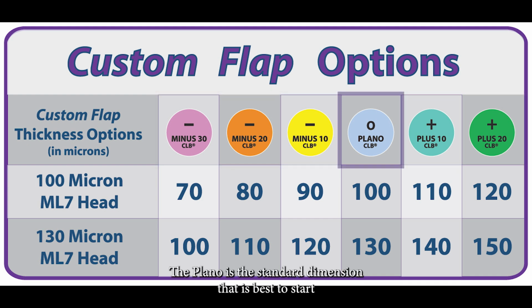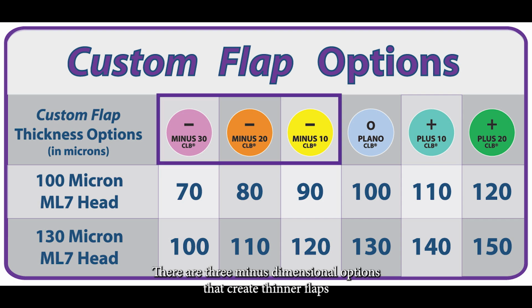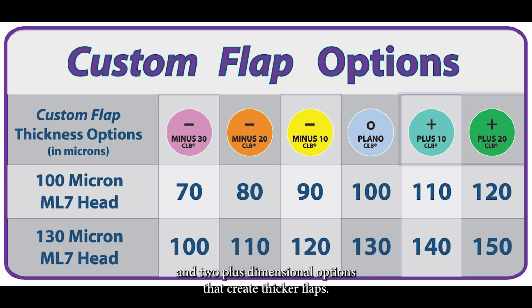The plano is the standard dimension that is best to start with to gain experience. There are 3 minus dimensional options that create thinner flaps and 2 plus dimensional options that create thicker flaps.